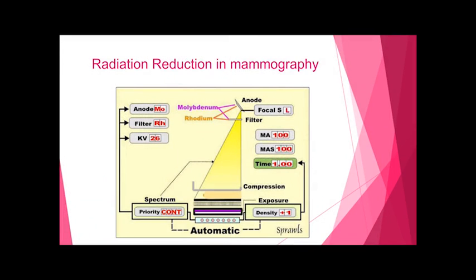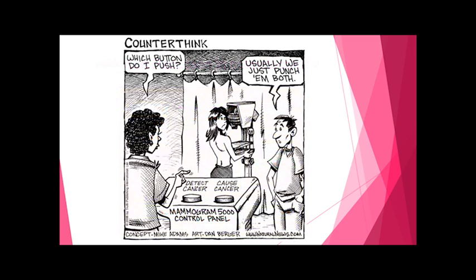Let's talk about radiation reduction in mammography. It's very important to keep radiation as low as possible because we know our patients come back yearly to be screened for breast cancer. It's even more important.